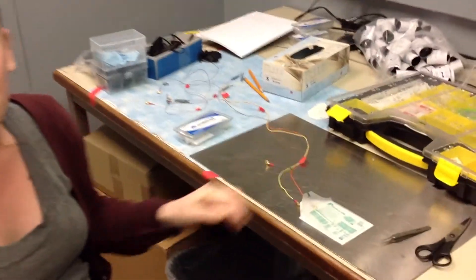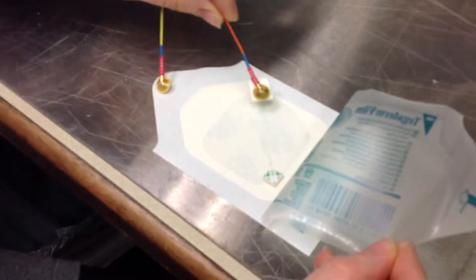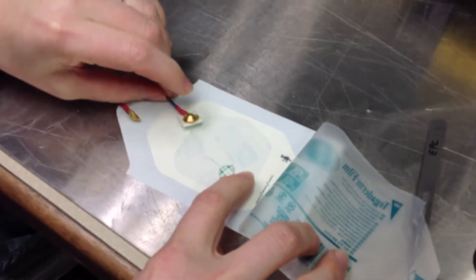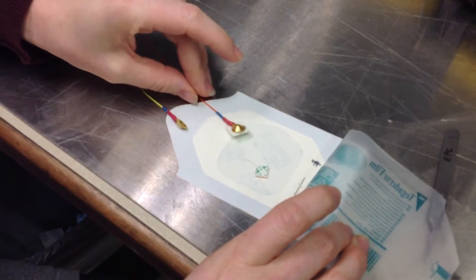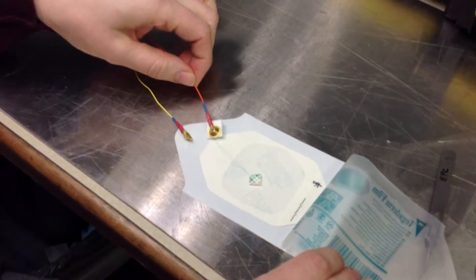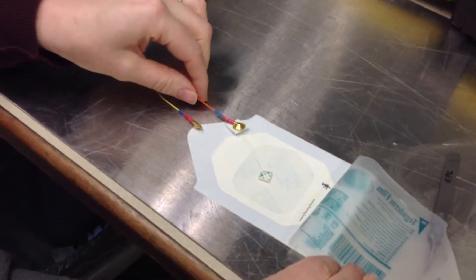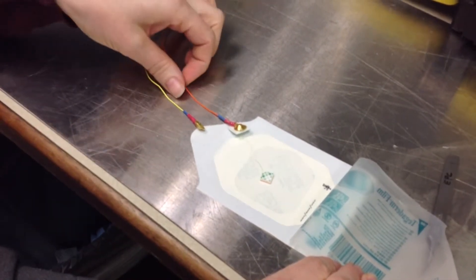This is actually the electrode that we use. It's just a little fiber, kind of thinner than a hair. We tape one portion where the eye meets the nose and tape another portion on the outside of the eye, so this little fiber is just laying very gently right across the cornea, just barely touching the outside of the eye. It kind of feels like a little hair at first when it first goes on, but it's really not anything more than mildly uncomfortable — a lot of people don't even notice it. Once you blink a couple of times it settles in, and it's not painful at all.